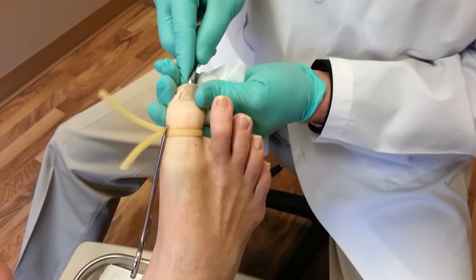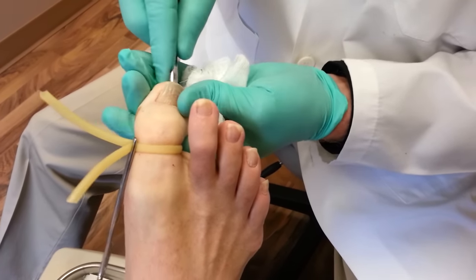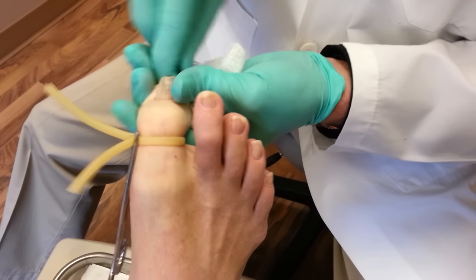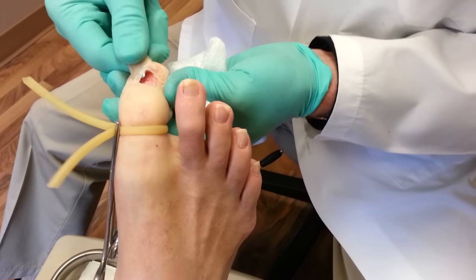Now do you feel any pain? You let me know. I might doze off — I typically do this when I do this. Okay, let's get the nail off.